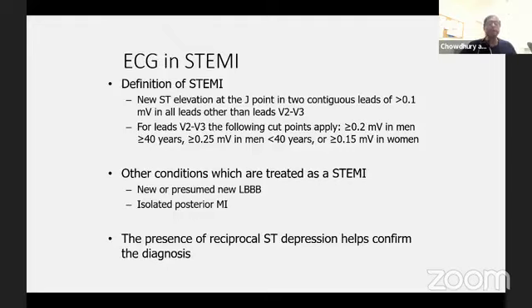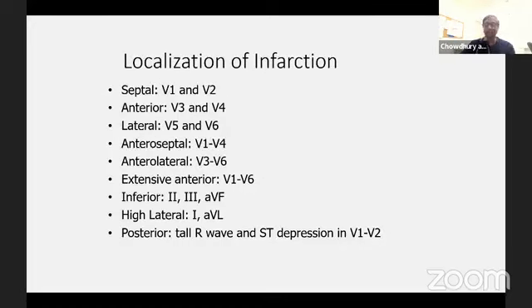We need to interpret the second part, which is even more important, which is MI, and that is clinical. So any ST elevation interpretation should be in the context of an MI presentation to call it a full-fledged STEMI. So EKG is not pathognomonic of STEMI.